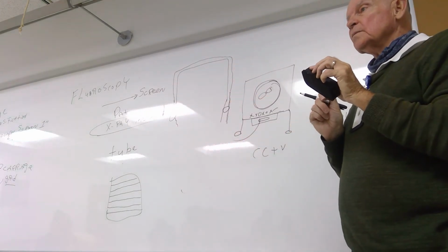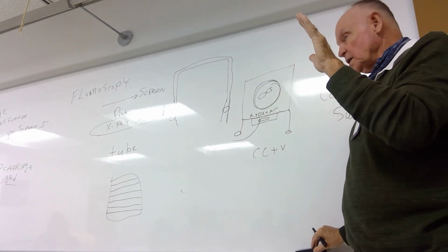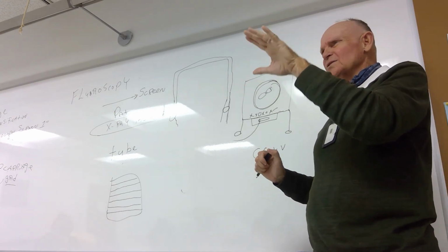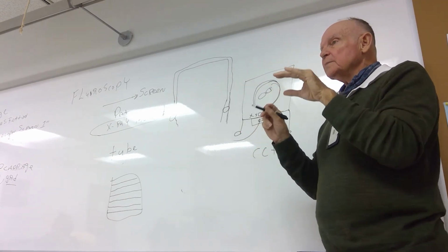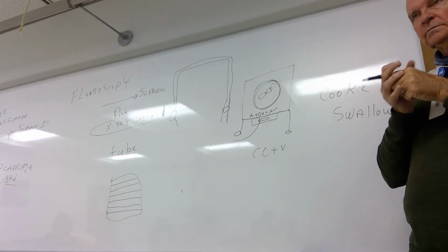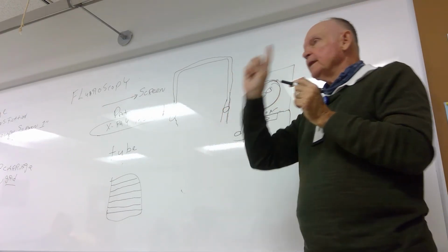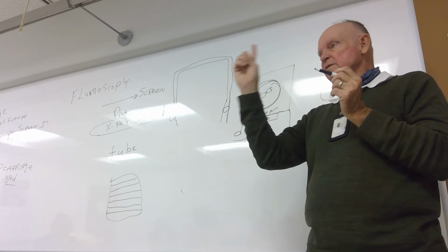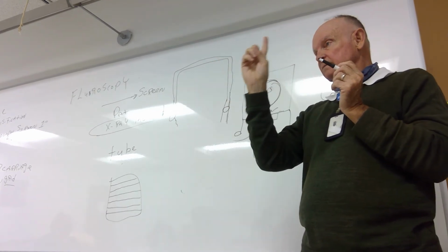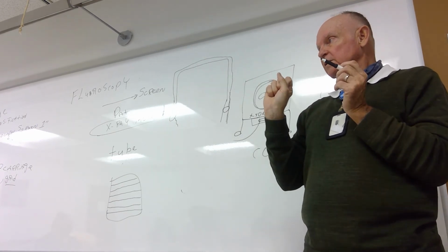That's an occlusion. Right. And this is the one I've brought up, it's called the what? It's adenocarcinoma, you guys will learn it, but it presents itself as an apple core lesion. So in other words, it grows in the circumference of the colon. All sides. So like an apple missing its core? Take the core out.